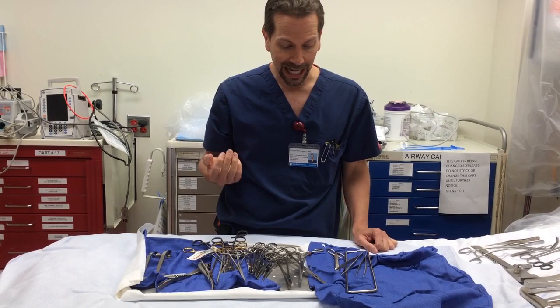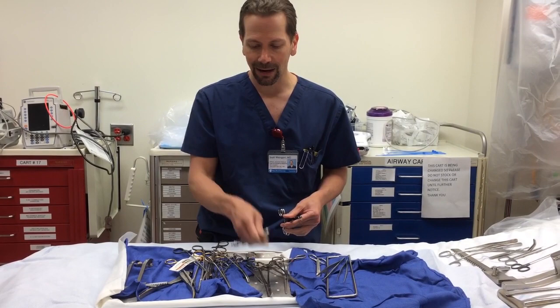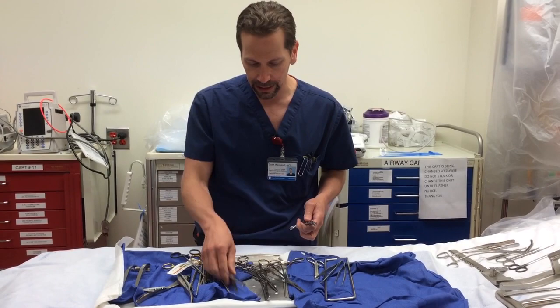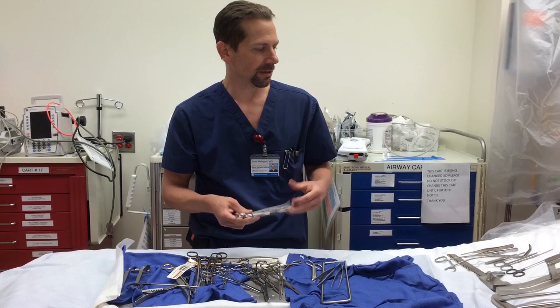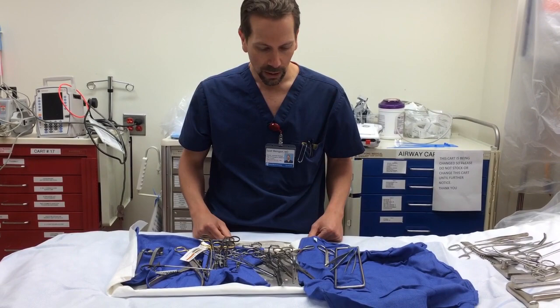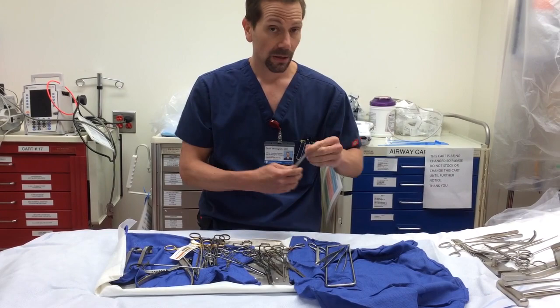If you've done a clamshell and the patient gets a blood pressure back, they're going to start bleeding from their internal mammaries, and you'll want to clamp those off. So you want four clamps — curved or straight, doesn't really matter. I have a preference for curved. Two straight and two curved, or some combination. One of those clamps could absolutely be used for a chest tube on the opposite side.